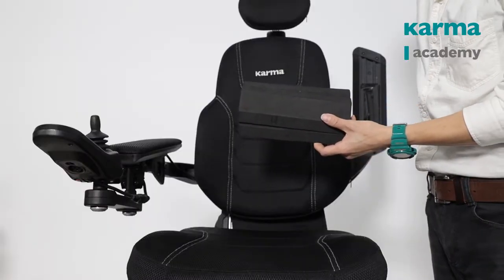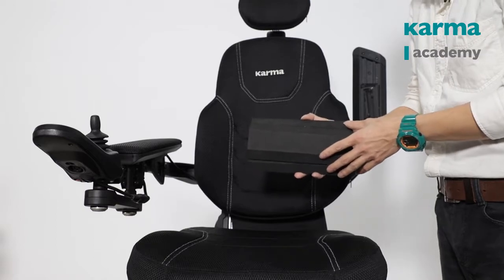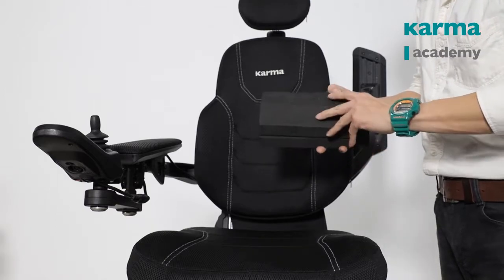The Altus and Lectus seat offers an optional lumbar support. If the user experiences soreness on the lumbar, we can add the lumbar support on the backrest.